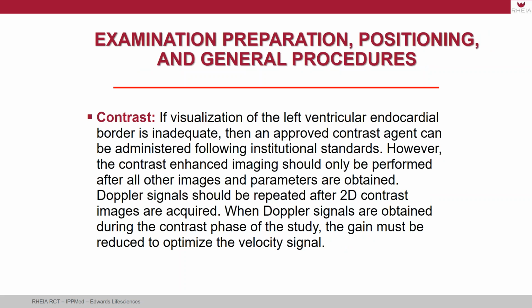So, contrast. You can use contrast if you want to enhance visualization of endocardial borders, but if you use contrast, please do it at the end of the exam, as we usually do, and please make sure that you acquire your spectral Doppler acquisition prior to contrast, because as you know, when you give contrast and you do Doppler afterwards, sometimes the signal is overgained.